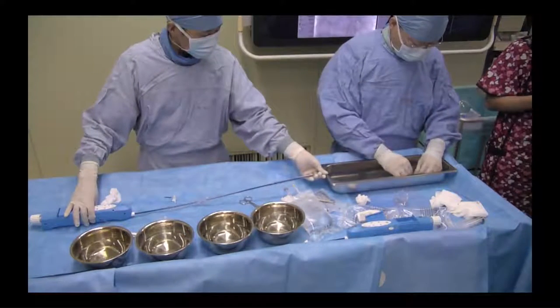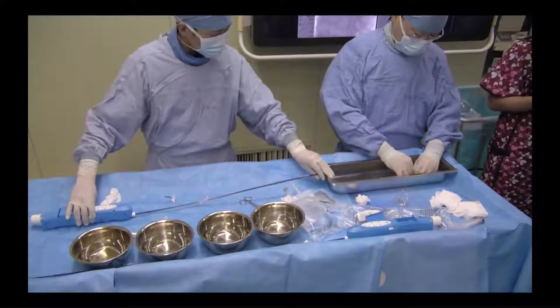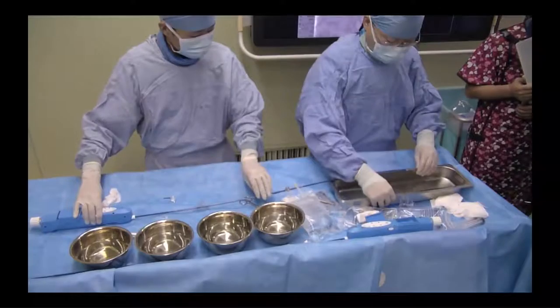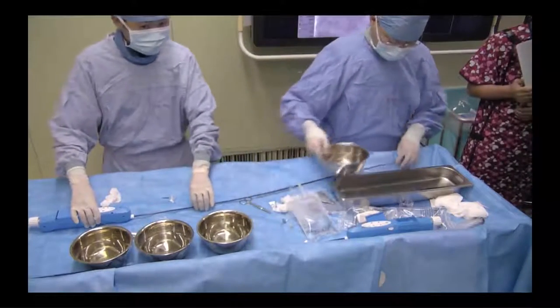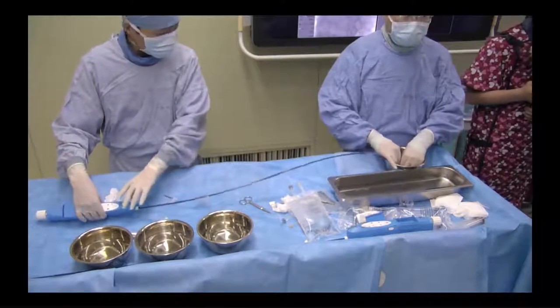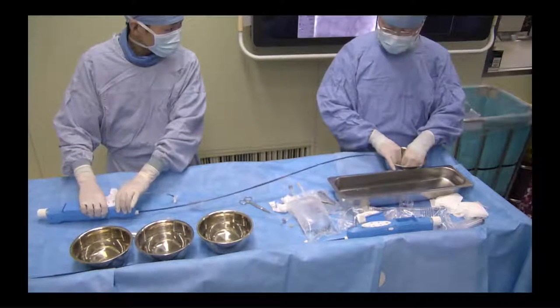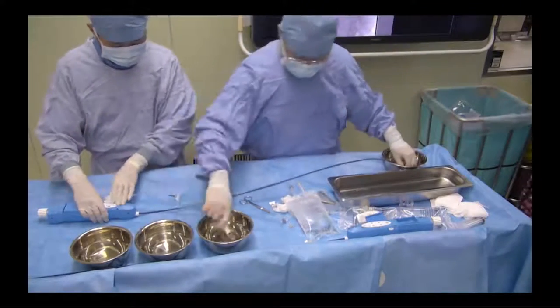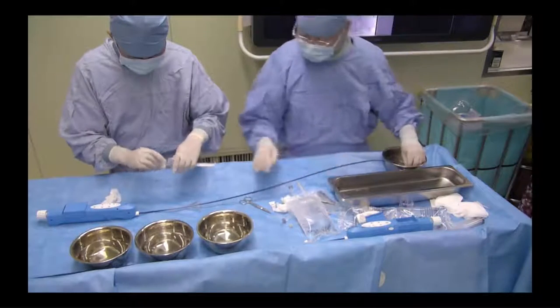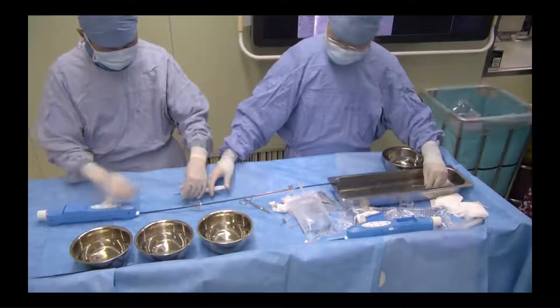It's interesting they've gone with the best of a lot of systems. They have bovine pericardium rather than porcine, which is a little thicker, interestingly. I don't know if it's anti-calcified. They have open cells at the top, which is a bit more like a Portico than a CoreValve. I believe the bottom is a little bit flared like the Centera, at least in an earlier version I saw. And then it has an external skirt like the Sapien 3. So they've taken, I think, the learnings from a lot of different valves and combined them.